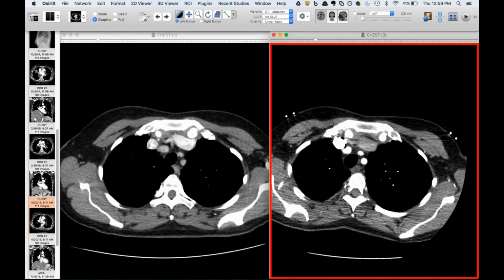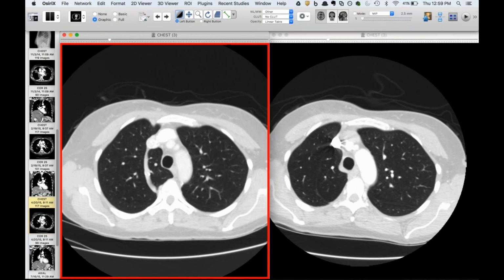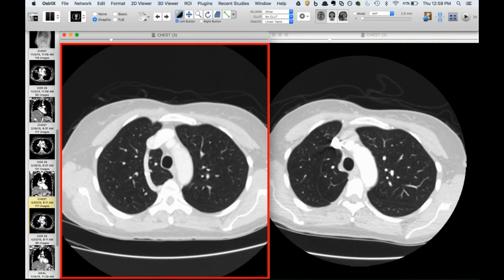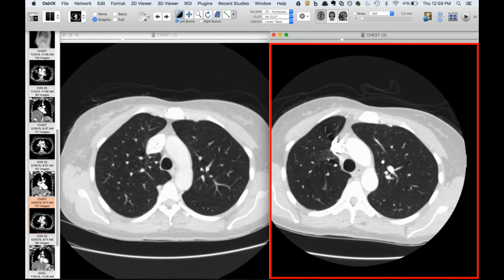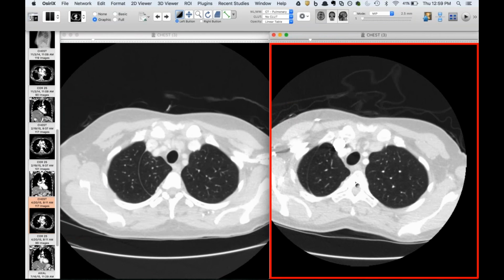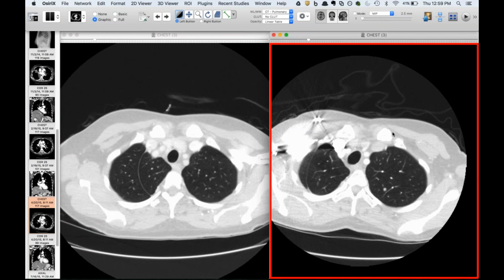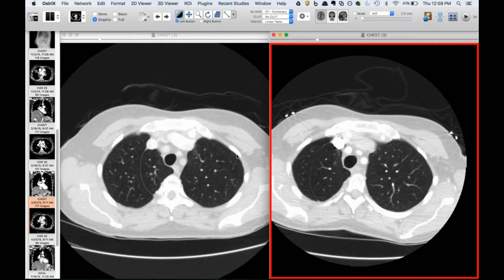So there was a paper, I think in AJR, probably within the last 10 years, that talks about this. And if I recall, it said, or at least another paper said, it can either go back to its normal position or it can hang out at the lung, like at the top of the lung. There's a difference in the thickness because you lost 2 layers of parietal. Oh yeah, and Chris made a great observation. Look at the change in the thickness of the fissure after you lose 2 layers of parietal pleura. Huh. Yeah, that's a good point.